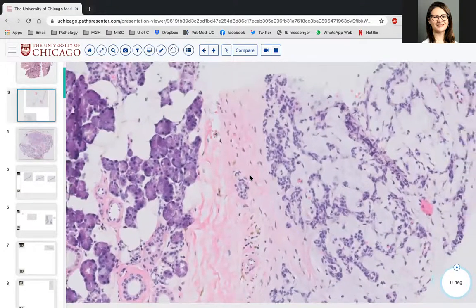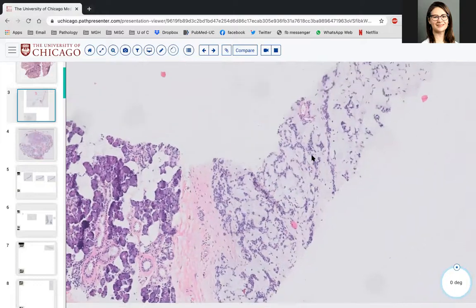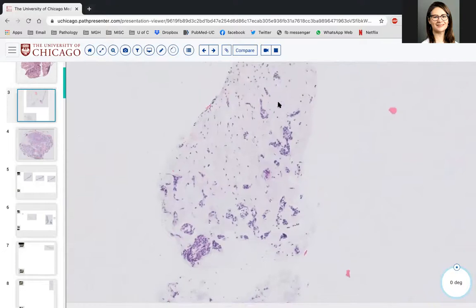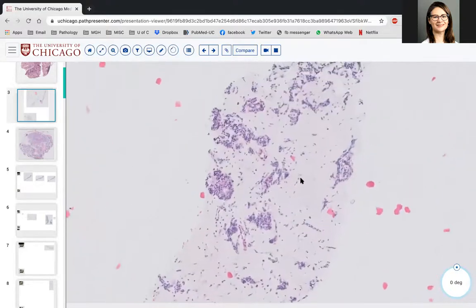we really try not necessarily to make a firm diagnosis of pleomorphic adenoma, because the morphologic features between PA and the other biphasic, myxoid stromal rich salivary gland neoplasms can overlap very extensively.